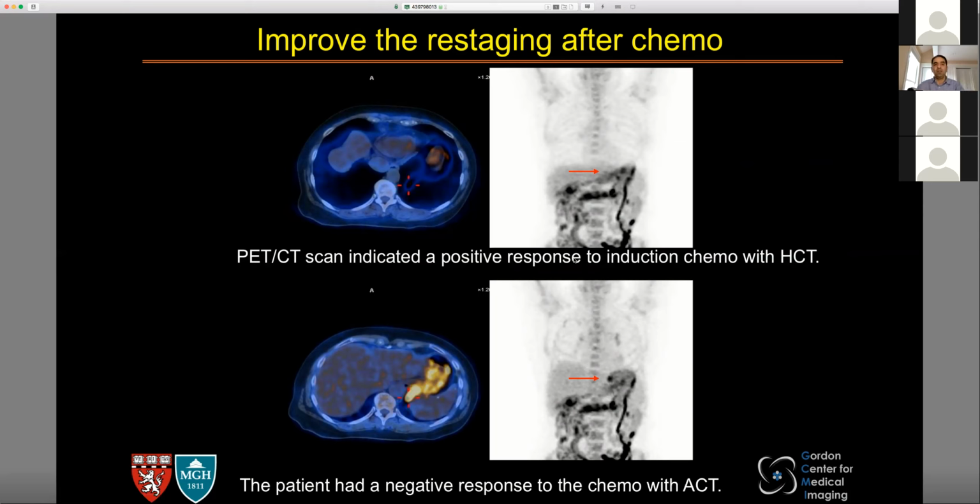So you can see that this can have dramatic effects on not just image quality, but also on the outcome of the scan, and outcome actually of the patient, whether we consider them responding or whether we switch them to another treatment. So it's not a small innocent thing, and that's partially why several groups work really hard on doing this in the clinic, because it has a lot of impact.